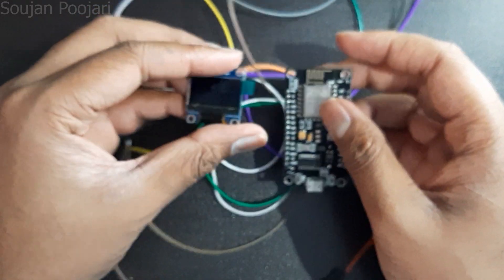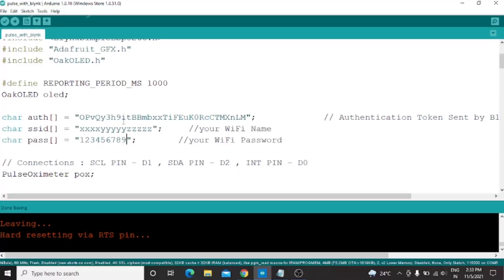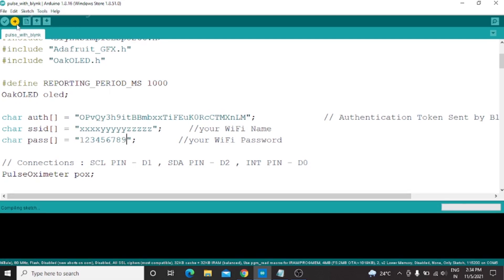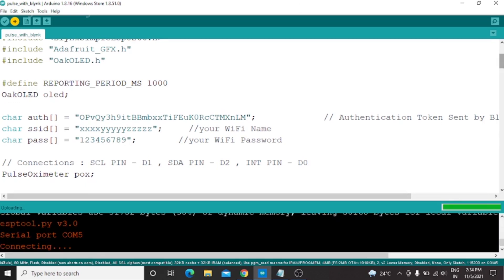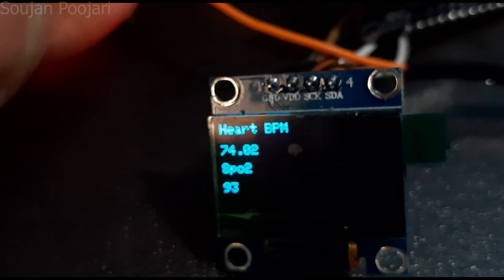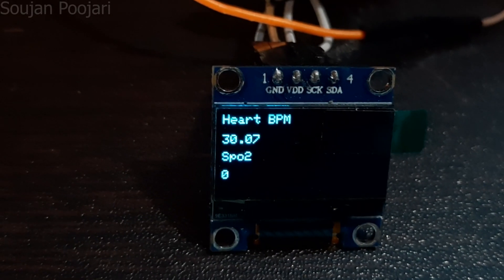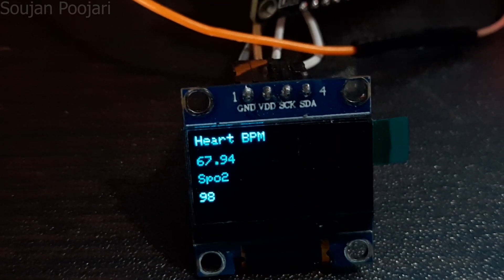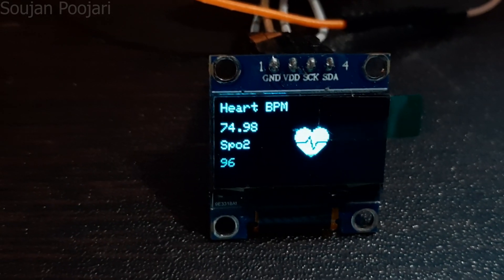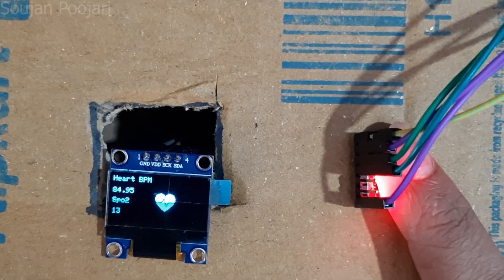Now the project is ready. Our project is working super well. A good idea for wire management is to place everything in a small box, as shown in the video.